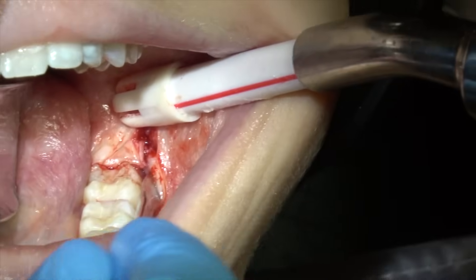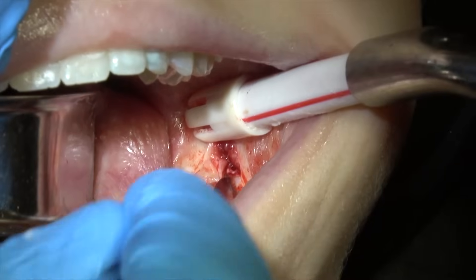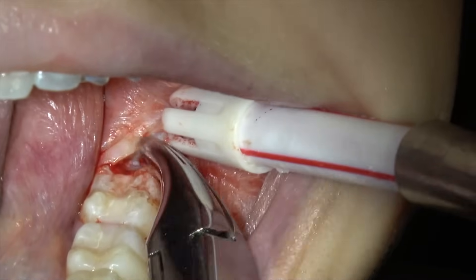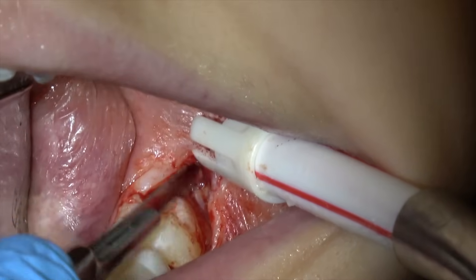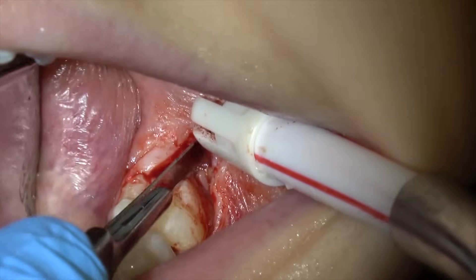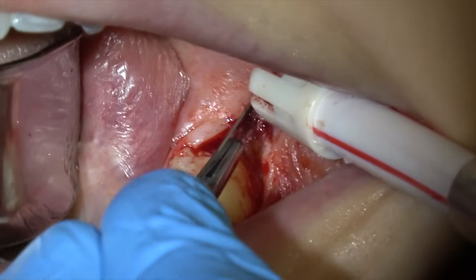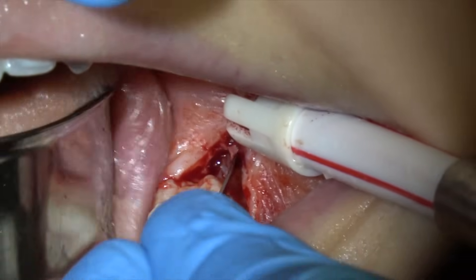Then I'm going to reflect the flap. I'm removing that piece and you want to be sure that you've got plenty of opening, that you have plenty of reflection so you can get to the tooth.